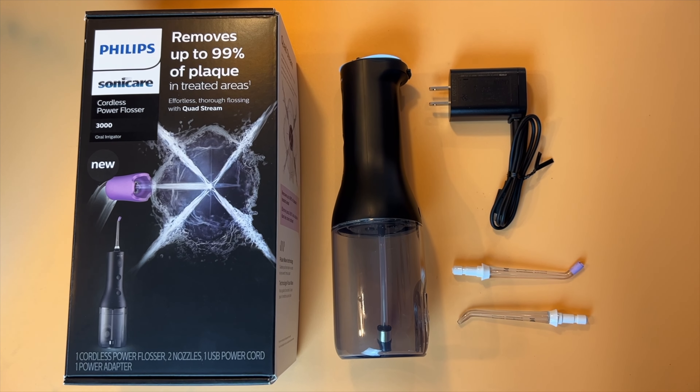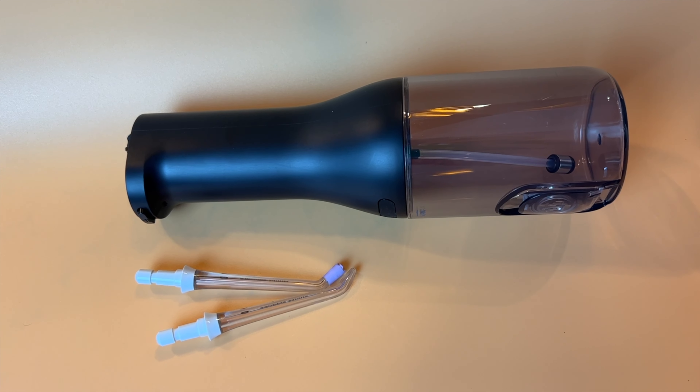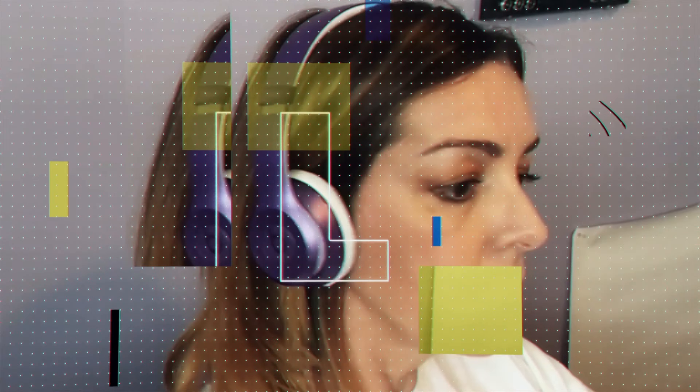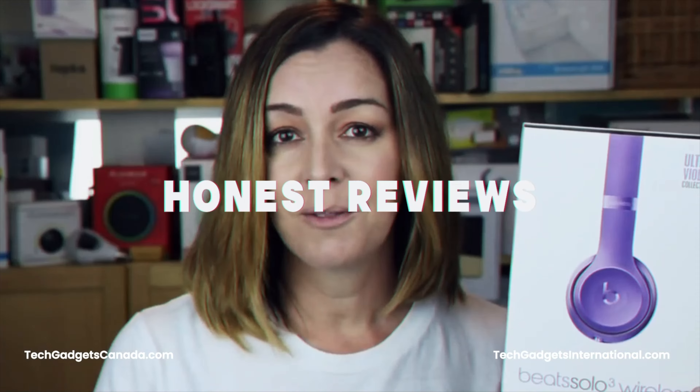In this review, I'll show you what you get with the Philips Sonicare Cordless Power Flosser, how it works, the special features it has, and what the overall experience is like. I'll wrap things up with the pros and cons and tell you if I think I can recommend the Philips Cordless Power Flosser to you.